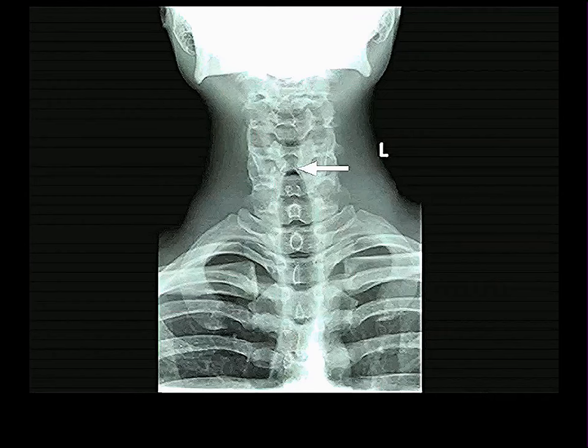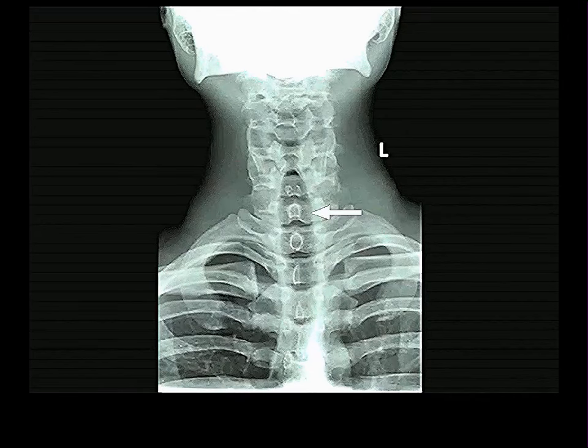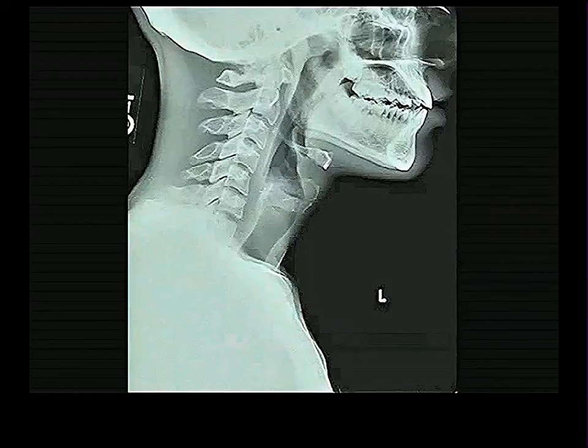Well, this whole thing is not the trachea. This is the larynx and trachea. And that narrow zone right there is where your vocal folds are, which is the narrowest part of your airway. All right? So from about C6 up is larynx, really, and from C6 down is trachea. And that's about all I can see in this.